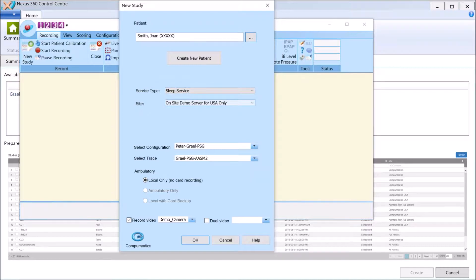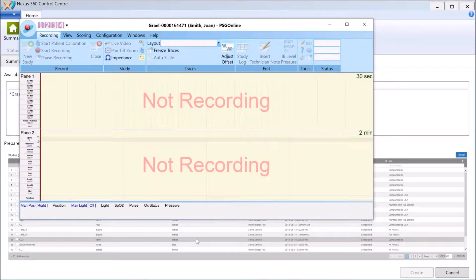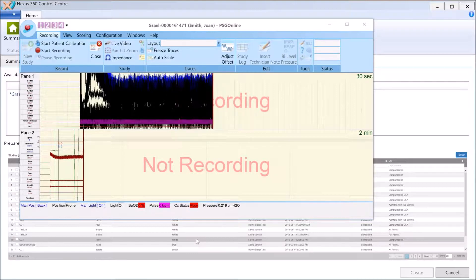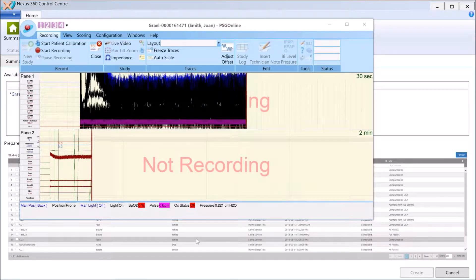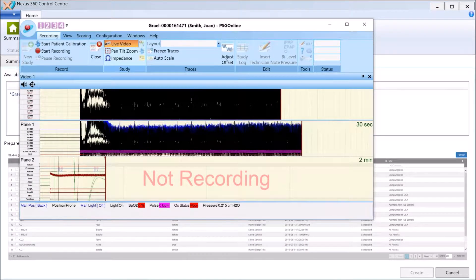You need to choose the correct service type and site. It's going to be a sleep study, and I've got a site within my Nexus 360 instance called On-site Demo Server. I've got my configuration file using a trace layout, and we're recording video here. I'll select OK. I don't actually have any patient hooked up, so the data is all noise and you'll hear the oximeter warning because the sensor is not connected.